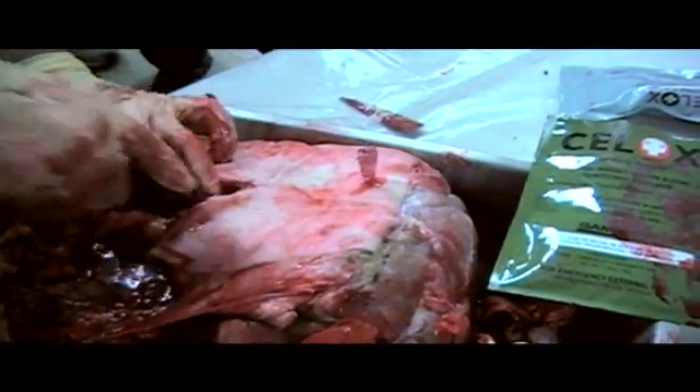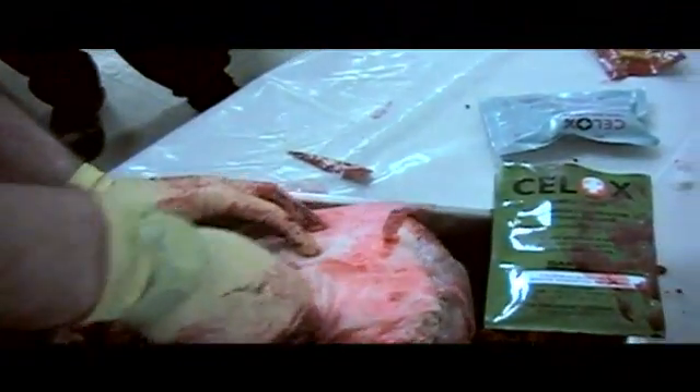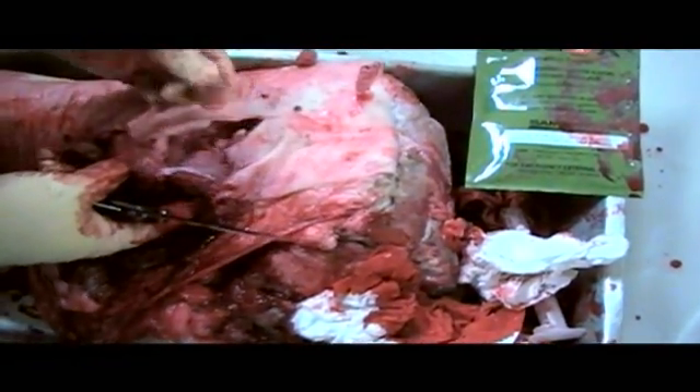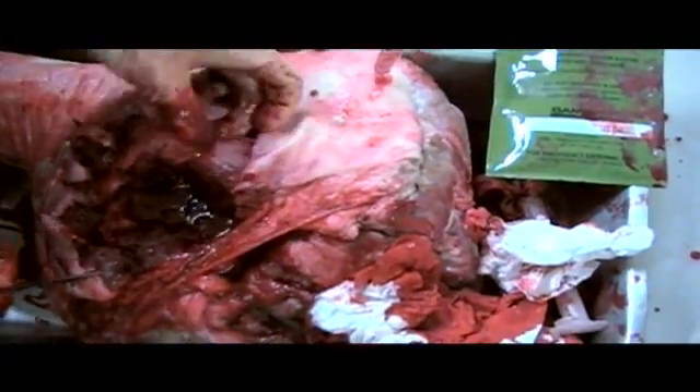I just want you guys to be able to see what this actually did in the channel. Same thing — you can see that down into the very bottom of the channel, the top of this is barely even wet, and it's all the way down to the base of the entrance wound.